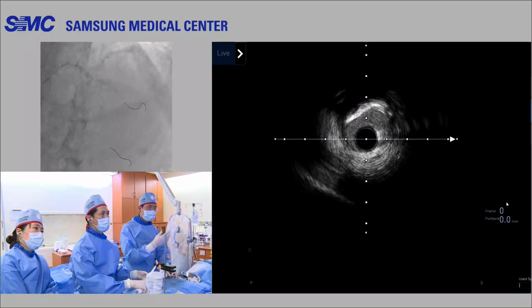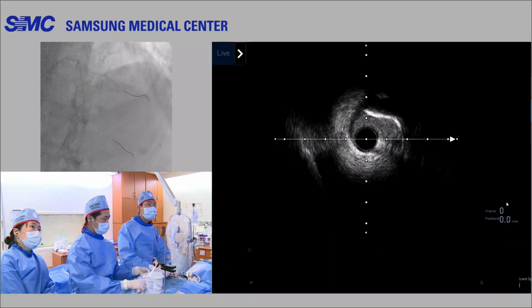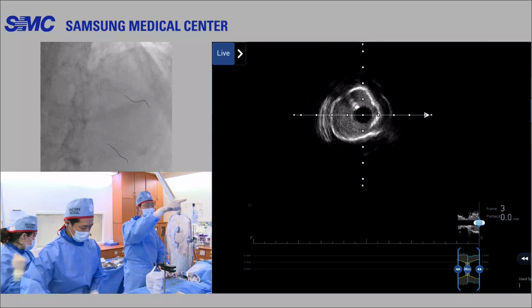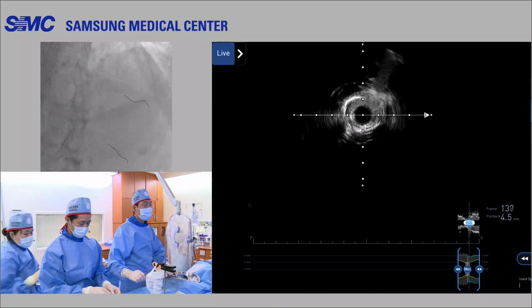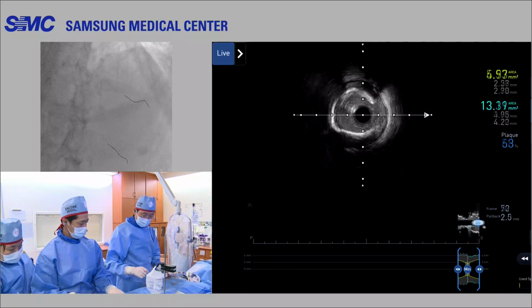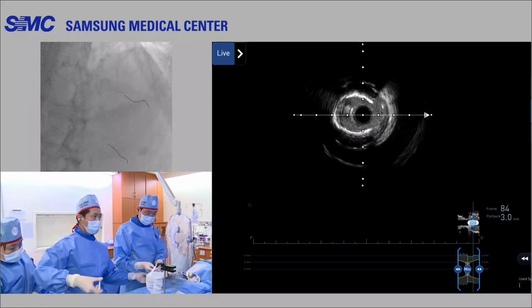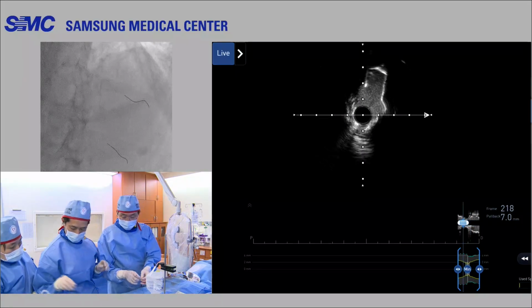2.75, 3.0. Yeah, similar. There is some contrast at 9 o'clock made by the cutting balloon. Is it the hematoma? No, I would like to see the vessel size, so I pushed and just cut it distally. It's the same vessel size, around 2.75 to 3.0. The diagonal ostium recoiled. Thus, it is fully dilated by a 2.75 balloon, but now 1.25 still.